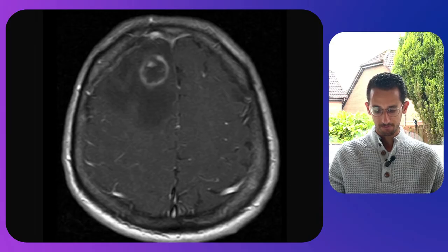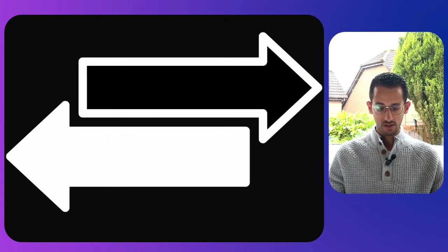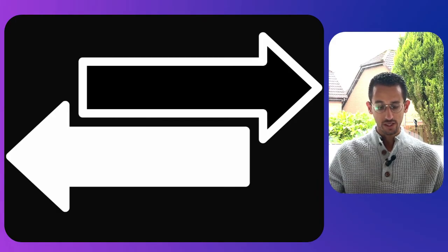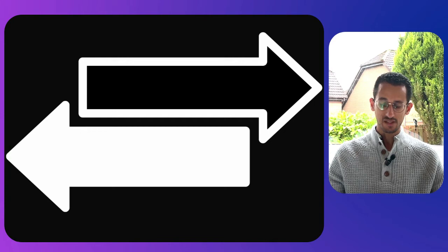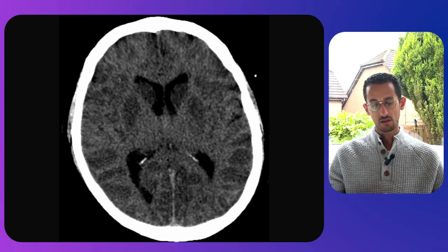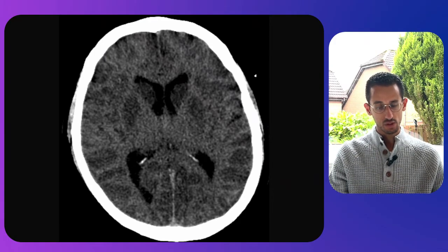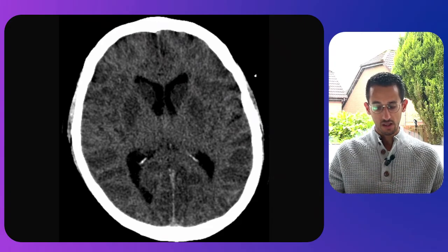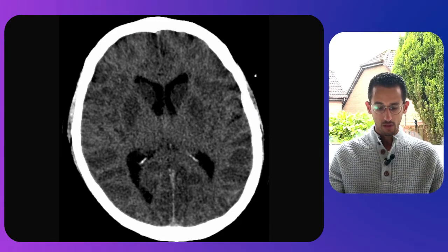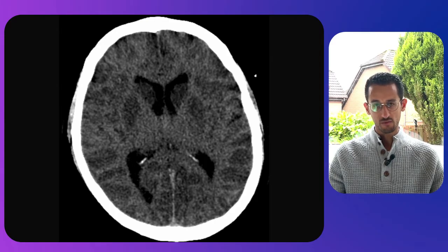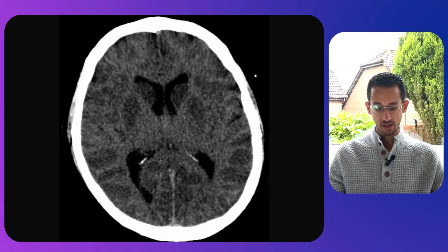The next is the reversal sign, where there is a reversal of attenuation between white and gray matter. On this CT scan you can see the inversion of attenuation — normally one is hyperdense and the other hypodense, but here the hyperdensity and hypodensity between white and gray matter are inverted. This happens when there is a diffuse injury to the brain.